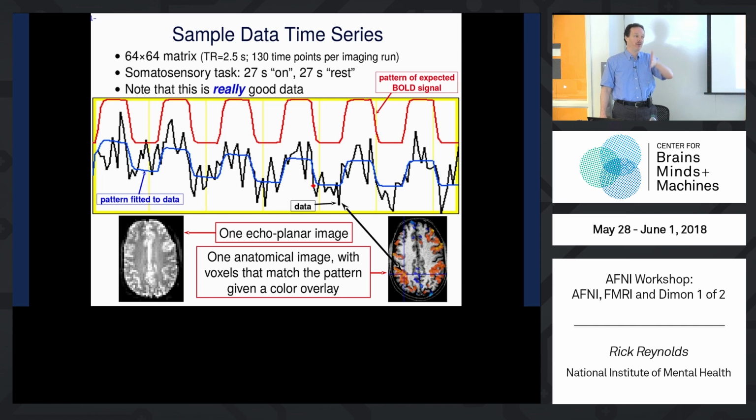But it's only with many repeated events and doing the regression with a long time series that you can get a beta weight magnitude of the BOLD response that you can rely on a bit. That's why you need many events, because the data may look like garbage, but over many stimulation events you can see, well, on average the signal looked like this. You can figure that out, or the computers can figure that out.